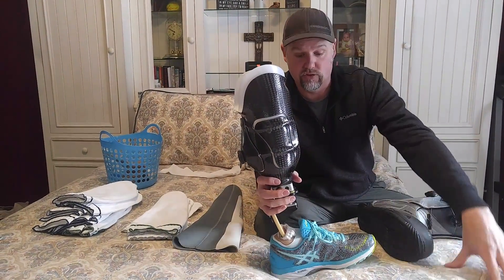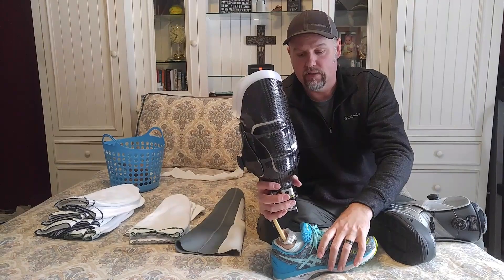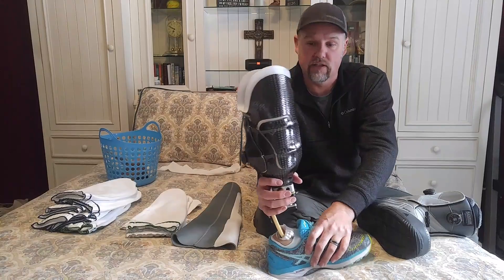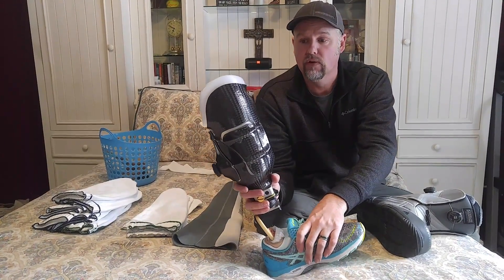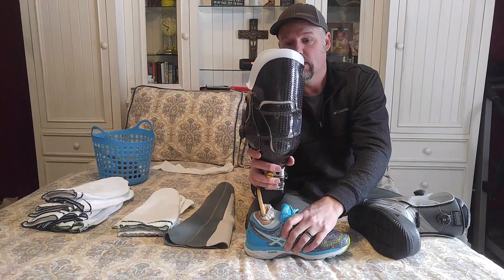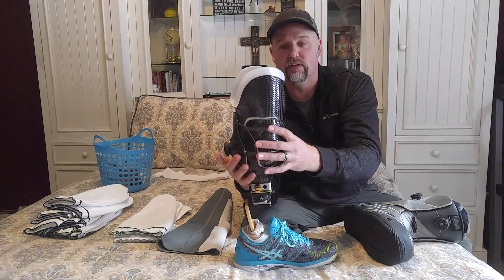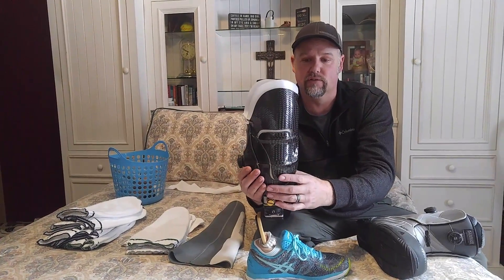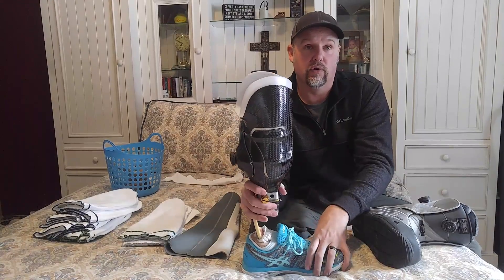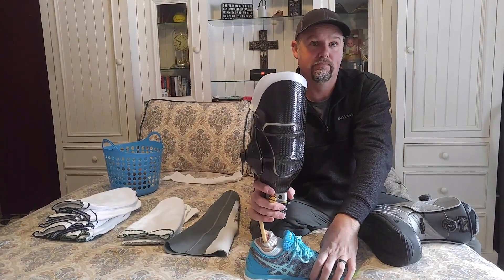Between the BOA system and the Rush Foot, this socket has really transformed Renee's life. She's only three months out from her amputation surgery — she really couldn't even walk before that — and yesterday she just started running on the treadmill. I wanted to give you guys an update on what the BOA system is and how it works, because I don't think there's a lot of information out there for the end user, the amputee. There's some pictures and stuff on how to build it for a prosthetist, but not a lot of info for the amputee. Now you've got some really good information on how it works, why it works, and how it's so beneficial to a brand new amputee.